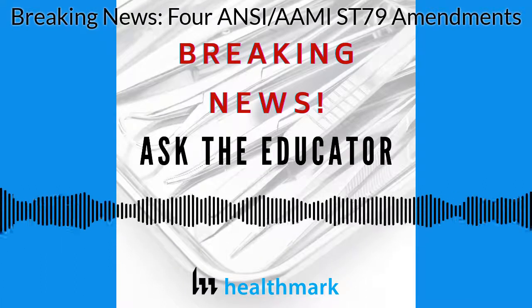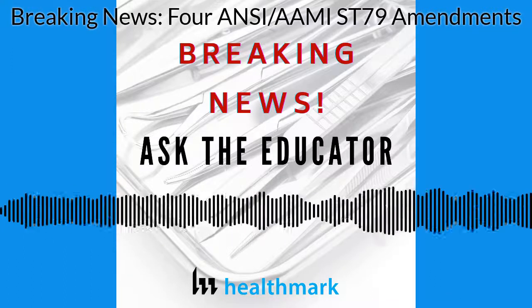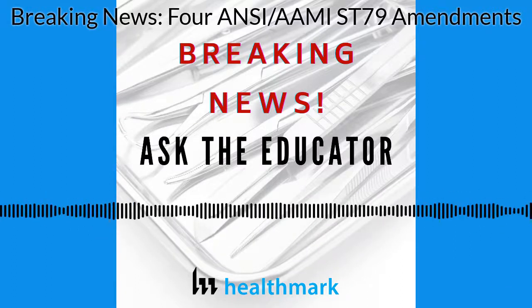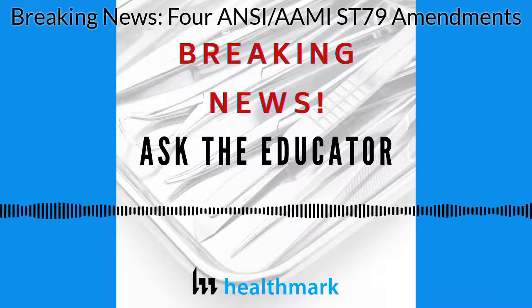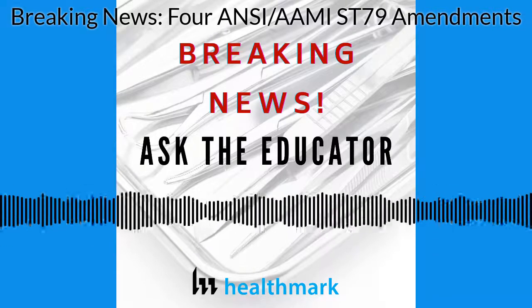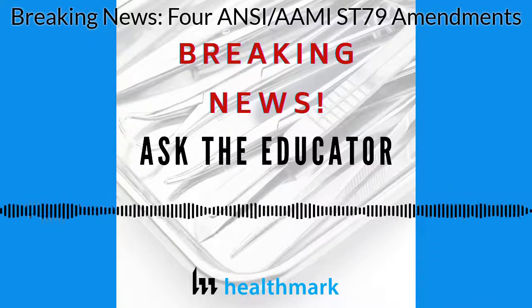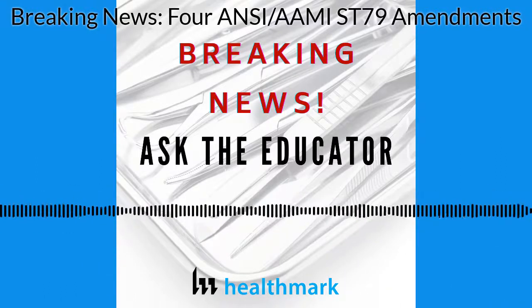Now, 8.2 talks about the inspection of all instruments and states that each time a medical device is processed, it should be visually inspected for cleanliness and integrity. Now, this may include the use of enhanced inspection tools like magnification, borescopes, or other inspection methods. And when using such inspection tools, do so according to the manufacturer's instructions for use. And another important point in this section is that it recommends all inspection equipment be present and available prior to the first use of the equipment.